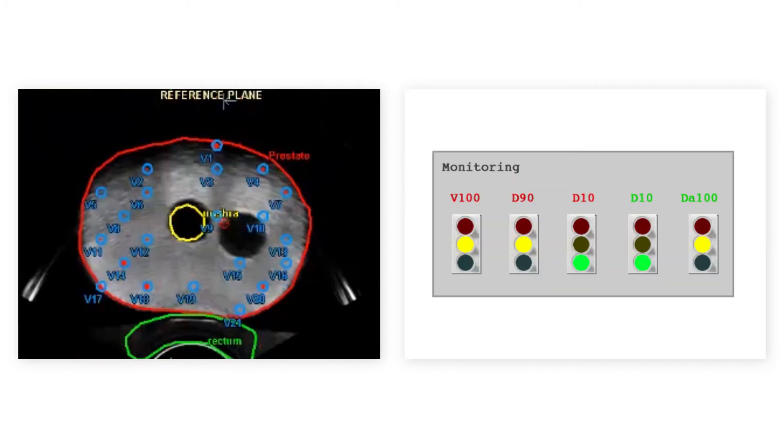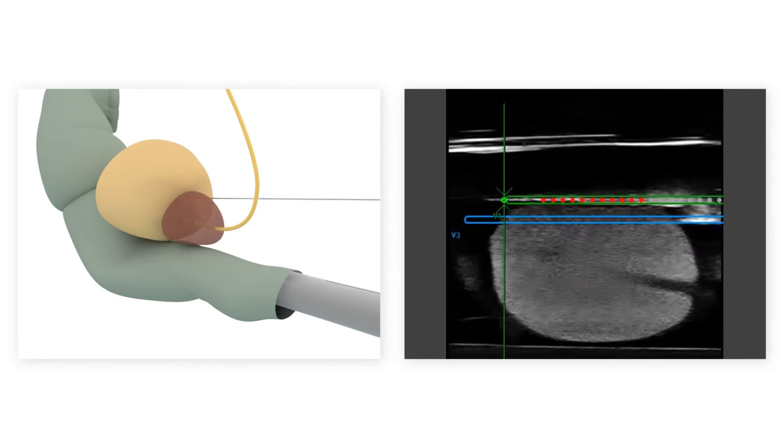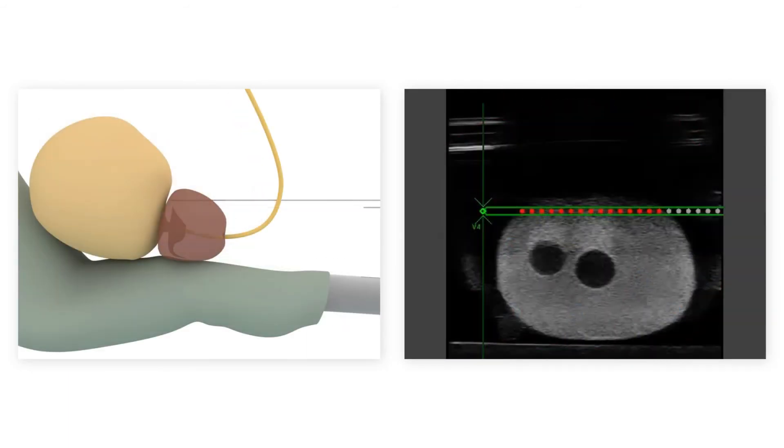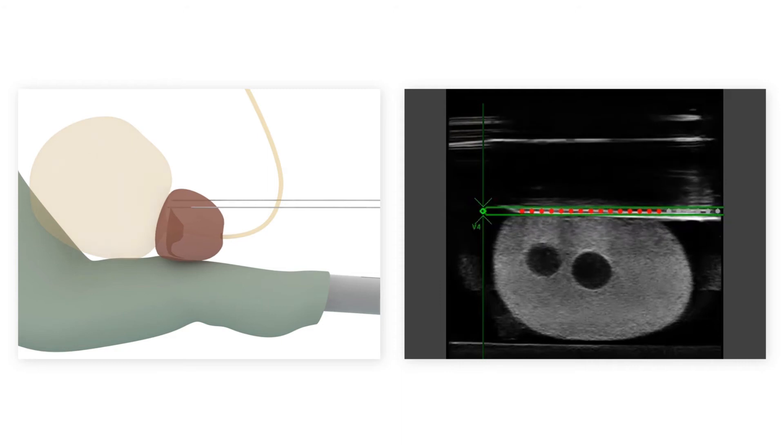With traffic lights for your presets, you can evaluate the planned dosimetry at a glance. The needle navigation technology helps you to insert the needle in the planned trajectory. Simply select the needle you want to insert and the probe will automatically be rotated to the correct plane. As a result, you can follow and guide the needle insertion live on the ultrasound image.